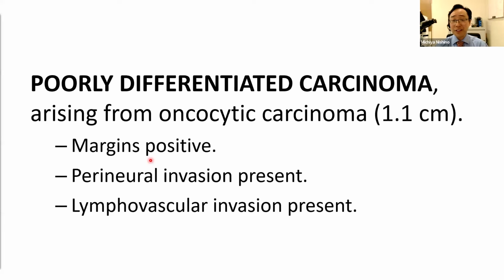And that was necessary in this case because the patient will likely require radioactive iodine treatment. And if we didn't know about the p53 mutation and how it was associated with aggressive clinical behavior, the small size of the tumor might have prompted lobectomy initially, and then that patient would have had to come back to undergo a completion thyroidectomy at a later date in order to initiate radioactive iodine treatment.